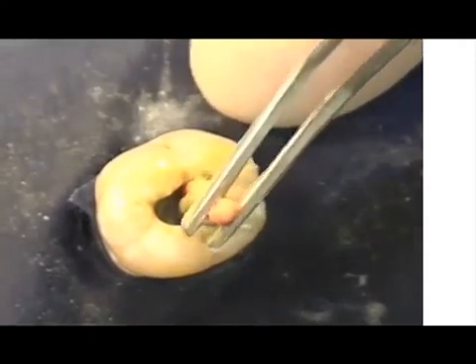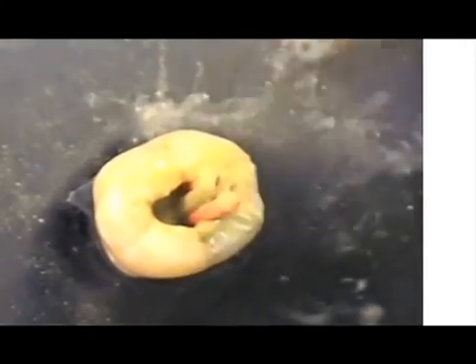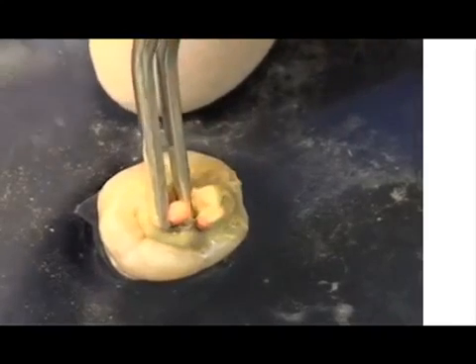Here you see me placing all 3 points at one time. In reality, after all the canals have been flooded with cement, I will place a point and burn the excess off at the level of the orifice before proceeding to cement the next point. As you can see, the canals appear to be well filled with no voids using 3 single gutta percha points.